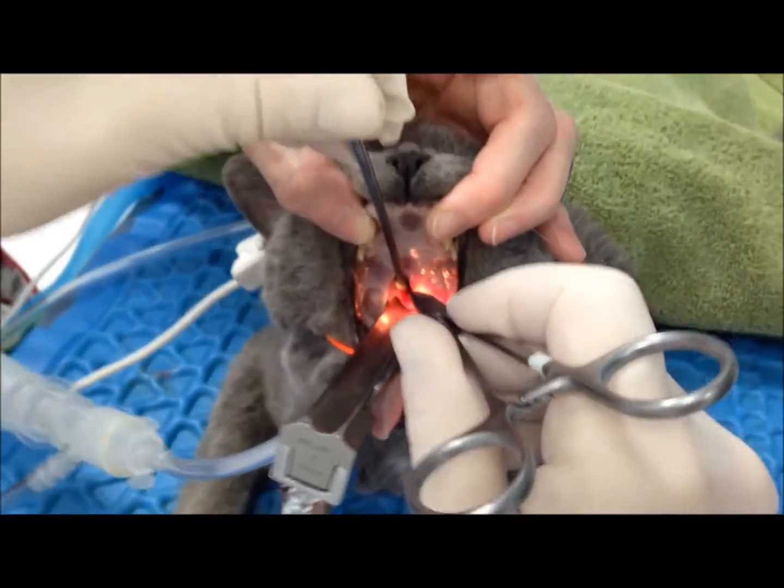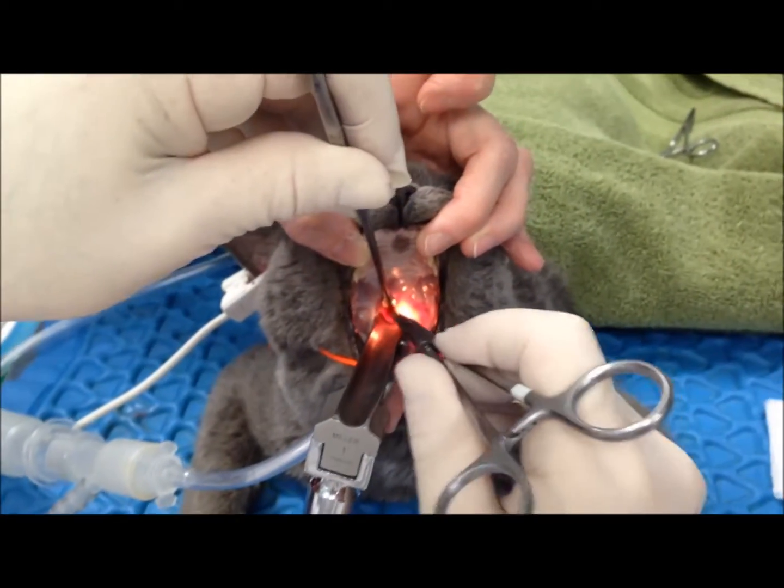This patient's webbing seems to be really quite extensive — there's a lot of it posteriorly.